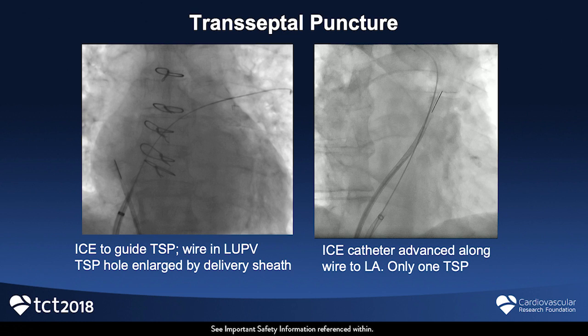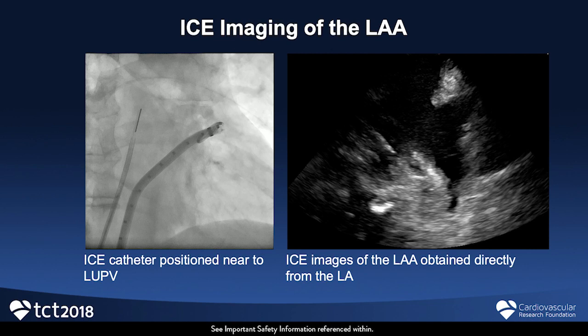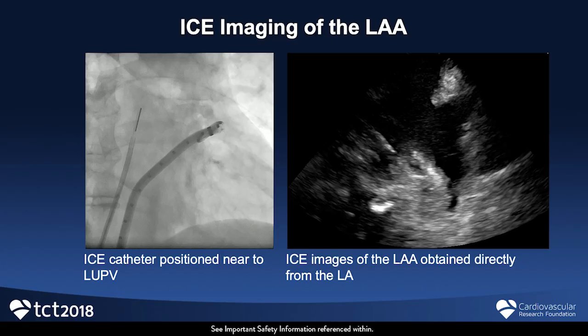It does take a little bit of learning, but once you get it, you can probably do it quite quickly. This is the imaging part of it, and I wanted to point one thing out here, which is the inferior nature of the stick. You see how inferior this is? When you do that, your life becomes so much easier. See how the sheath sits so low? If you take a really inferior stick, it's so much easier to access all this as compared to when you go here or high here.